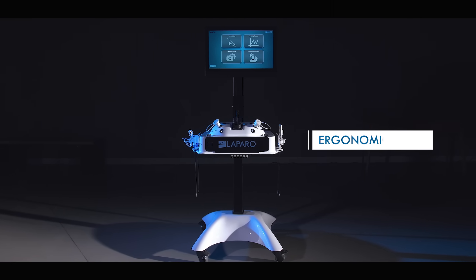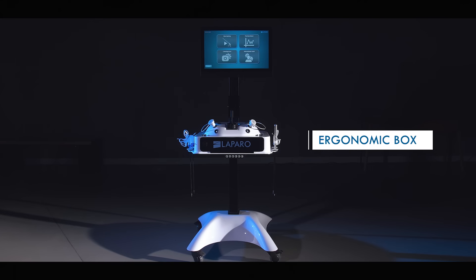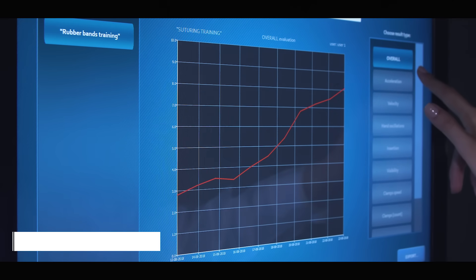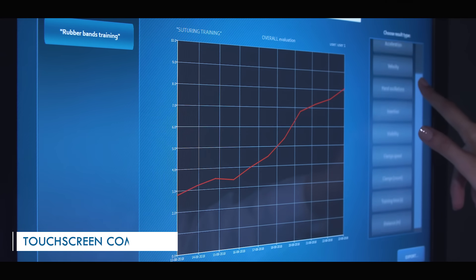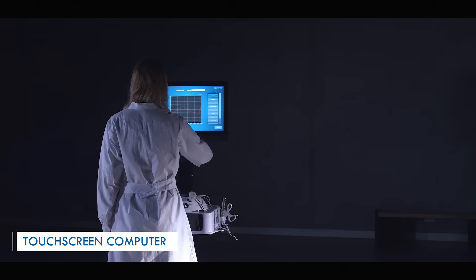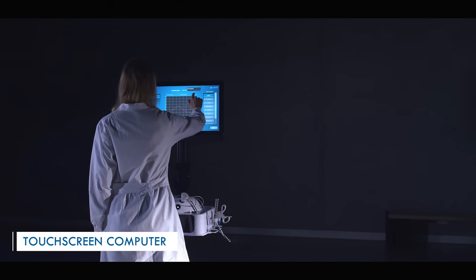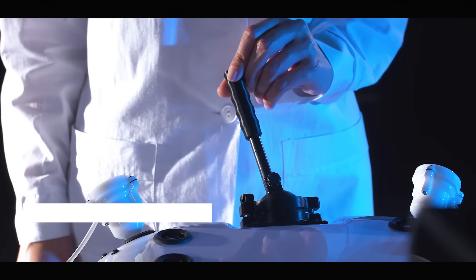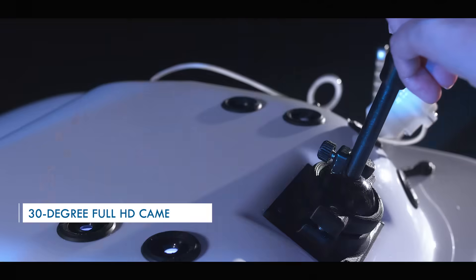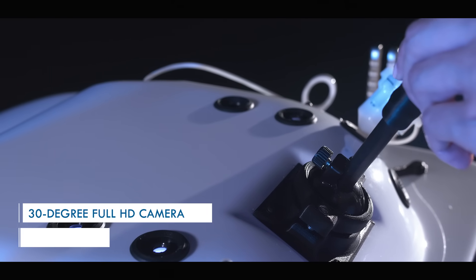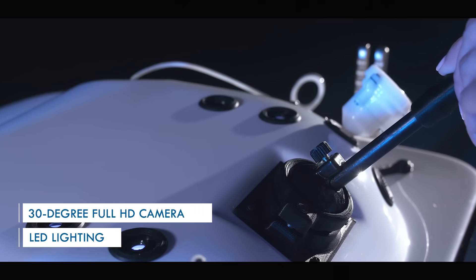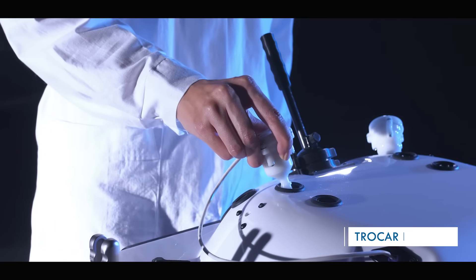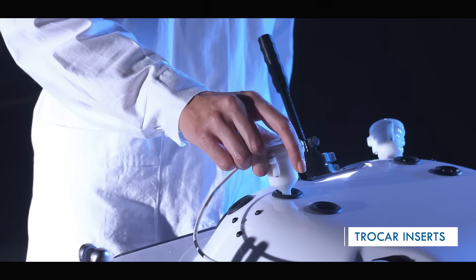LaparoAnalytic is an integrated training station with an ergonomic box and touch-screen computer. Inside, we find a 30-degree full HD camera with position-blocking functionality and LED lighting. The device has many properly placed inserts for the trocars.